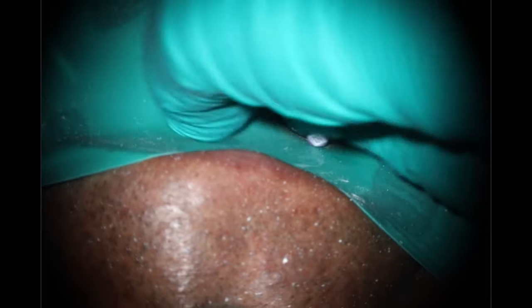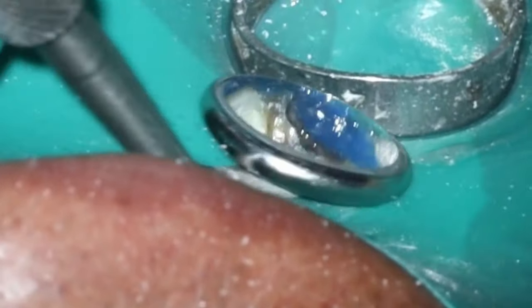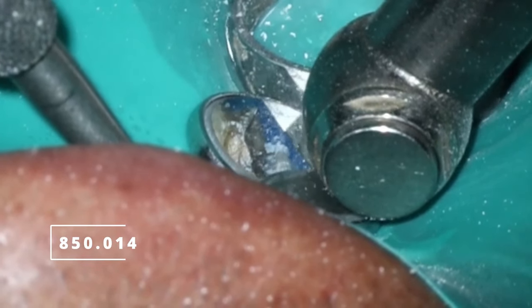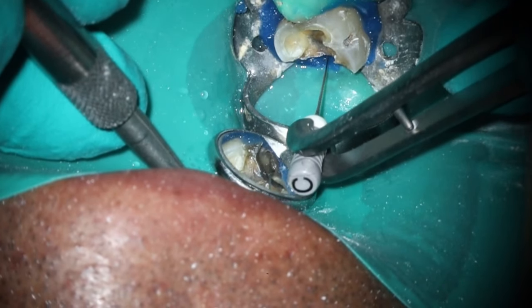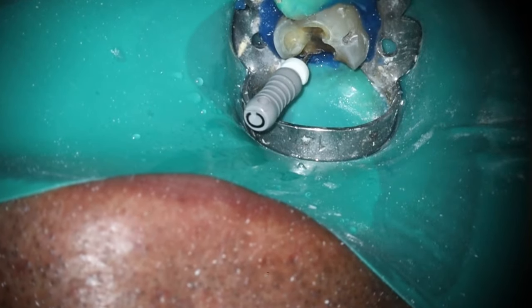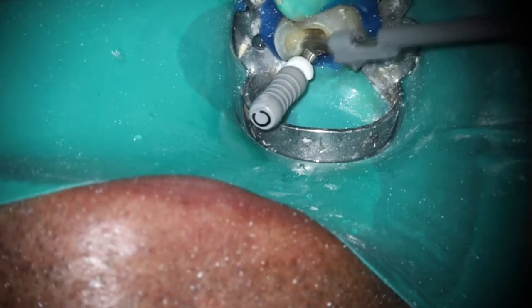I'm getting the apex reading but there's some leakage, so you can always just dry it, go in with air only, and try to get a reading that way. You can see I'm way shorter where the mesials are — trying to move it down, but unfortunately the block-out was just in the way. What you'll see me do in a second is remove a little bit more of the block-out — taking that skinny diamond and going in to cut it back. You can actually use the block-out resin almost as a barrier if you're doing restorative — a cool technique.